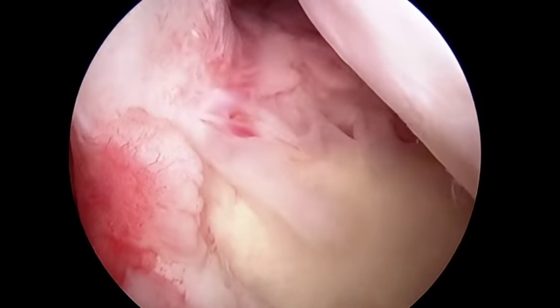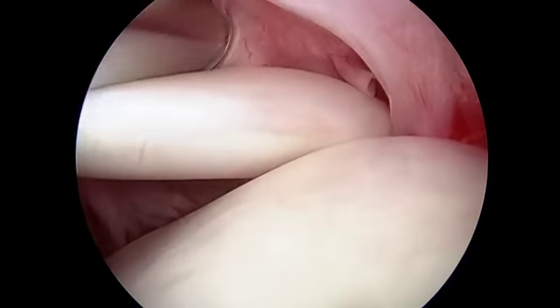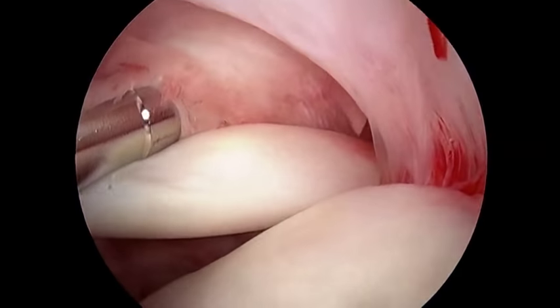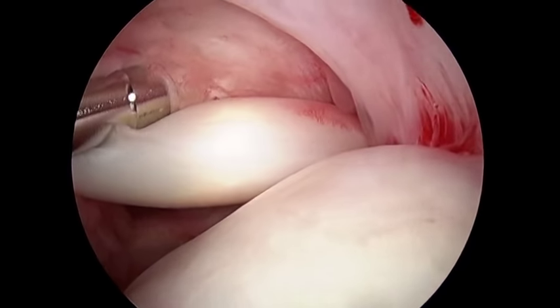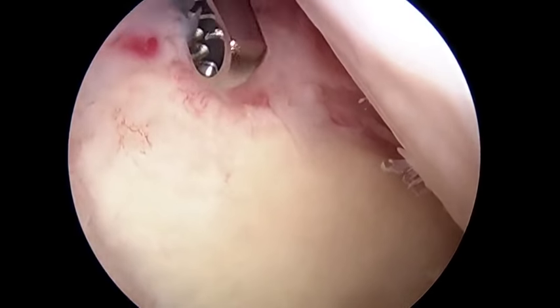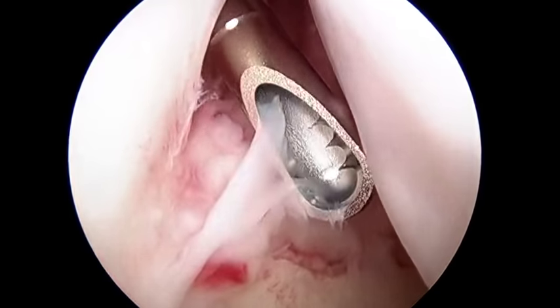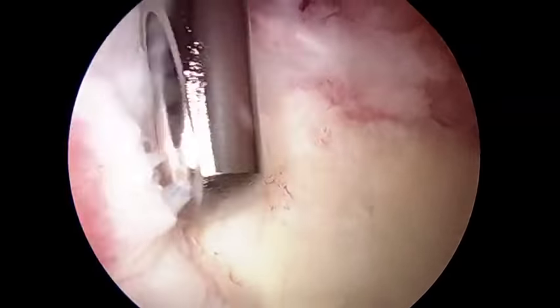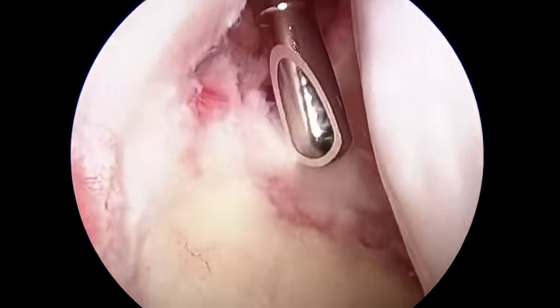The biceps attaches to the superior labrum here, and it exits through the rotator interval into the bicipital groove here. And the biceps is a little erythematous, which is not uncommon in someone who has a frozen shoulder or what we call adhesive capsulitis. And you can see that we have a synovitis in the shoulder, which is not uncommon in someone who has a sore, painful, stiff shoulder, i.e. a frozen shoulder. So we're just going to clean some of this out.